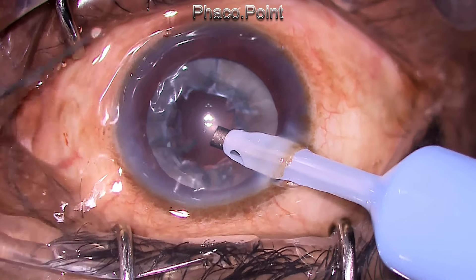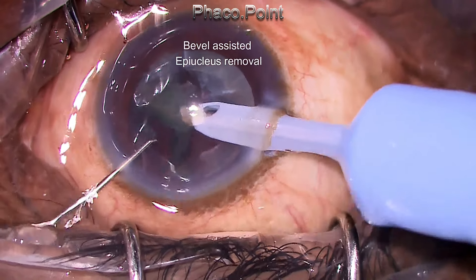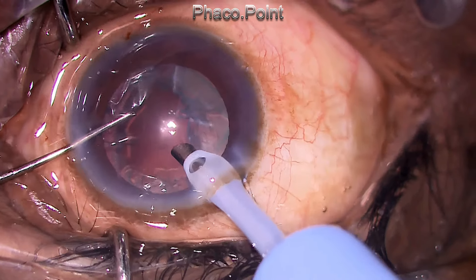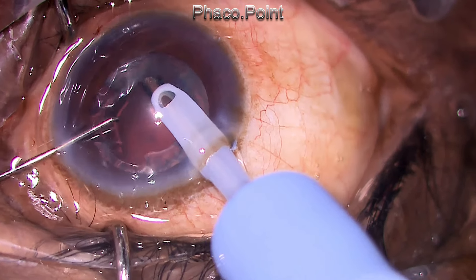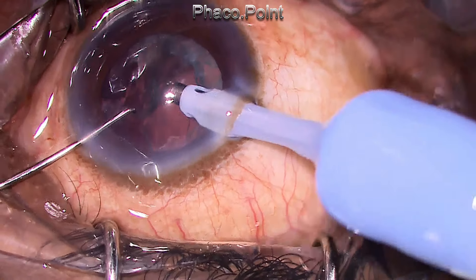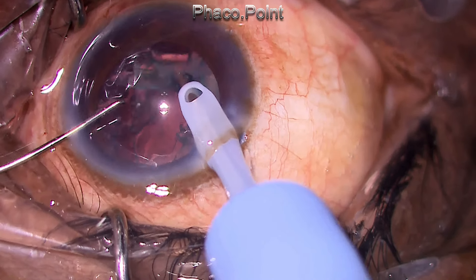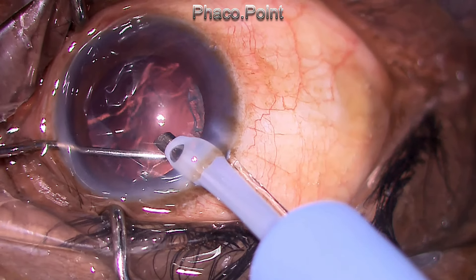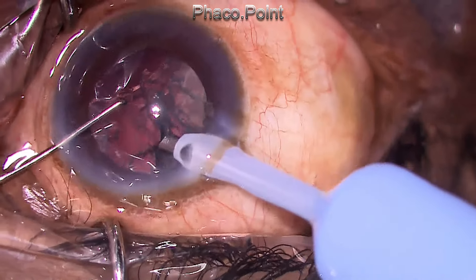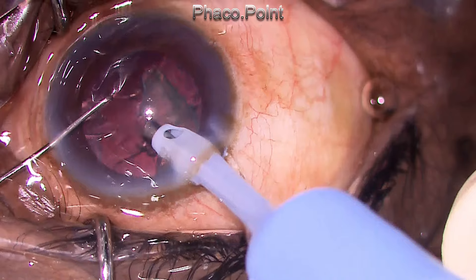The epinucleus is not going to rotate, so what I do is remove it by angling the bevel of the phaco tip towards the epinucleus and then judiciously applying vacuum in the epinucleus mode, also using a little bit of mechanical separation to tease the thick epinucleus shell from within the capsular bag. This again occurs without imparting any form of pressure to the run-off point.